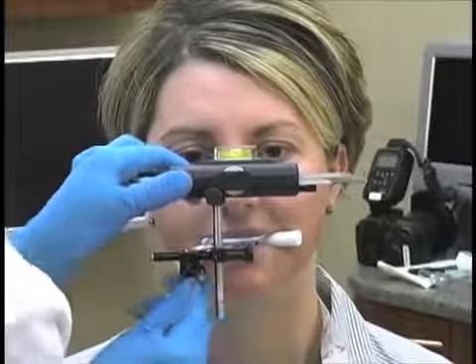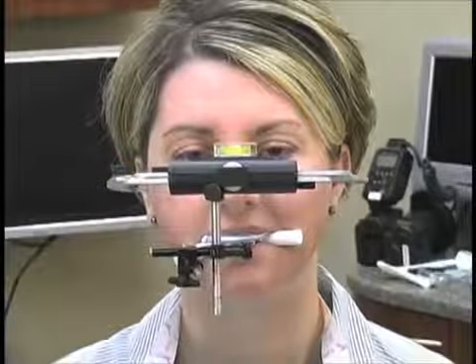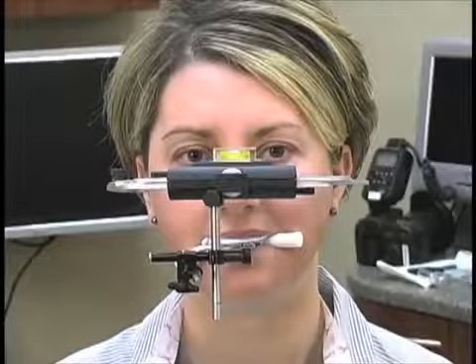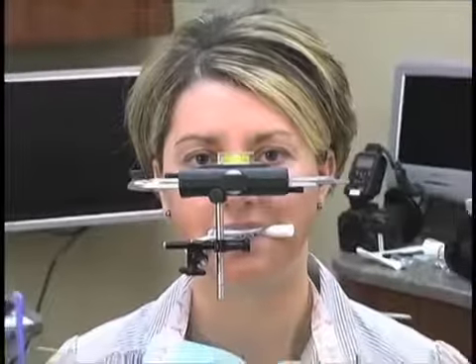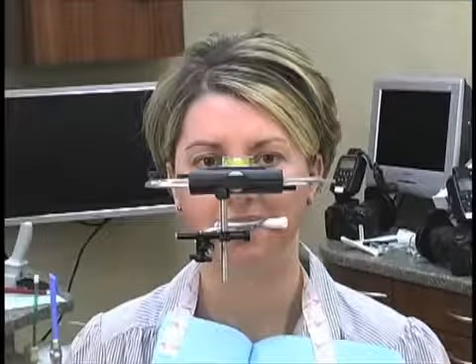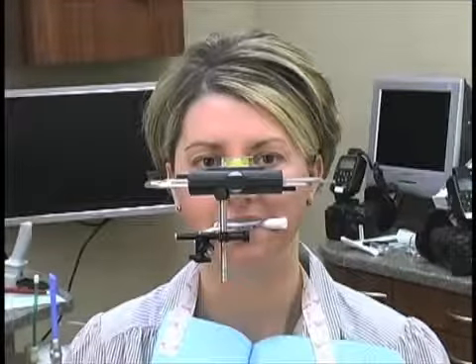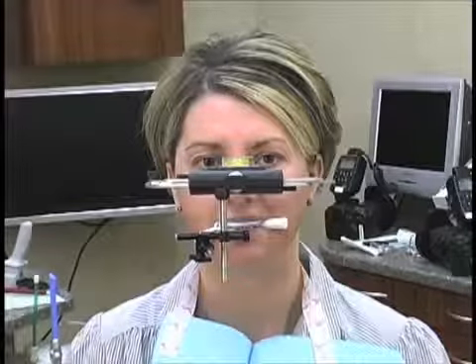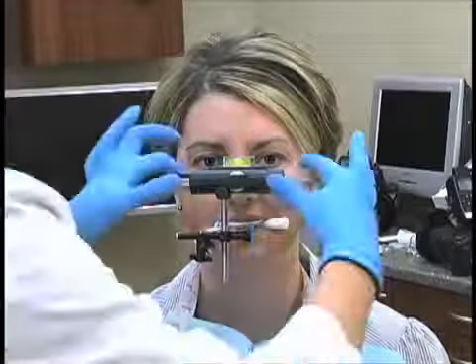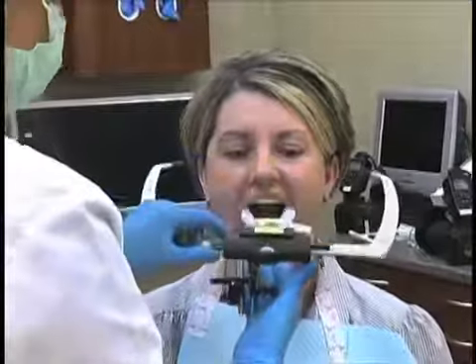Now what we've just accomplished there is taken this Facebow so that it's going to be properly centered on the articulator vertically, and we've now paralleled that Facebow so it'll be directly parallel with the top of that articulator. And again, the key point here is any cants that exist in this patient will be seen on this articulator. That maxillary cast is going to be hanging on that instrument exactly how the maxilla is hanging in the patient's head. Okay, so at this point, all we have to do is just loosen up that Facebow. Patient opens up, and we're done.